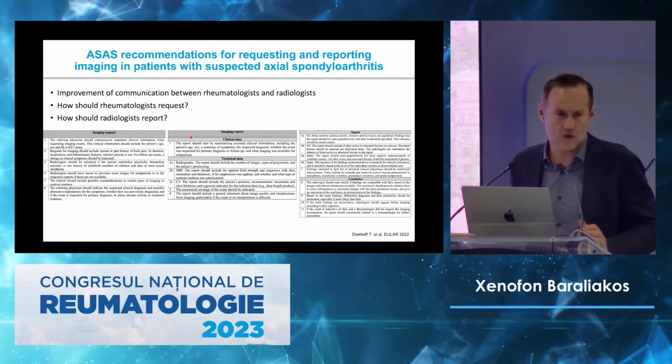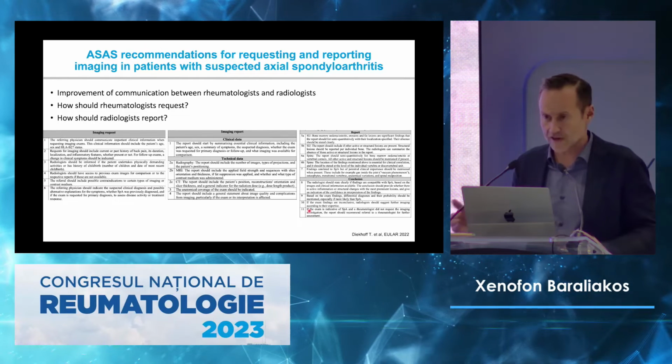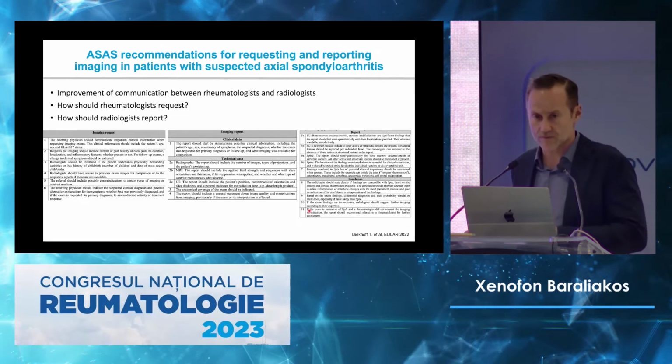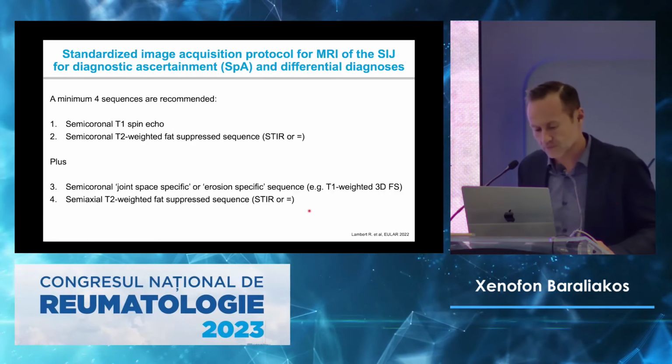And the radiologist has more work to do. They now have 11 points that they have to give us back. So that's the information we want to get. That's the information we want to give, so that we have equal and good communication.